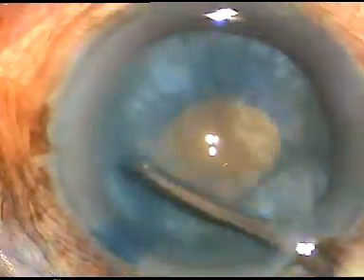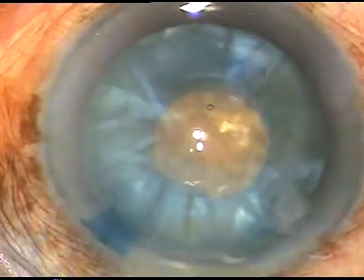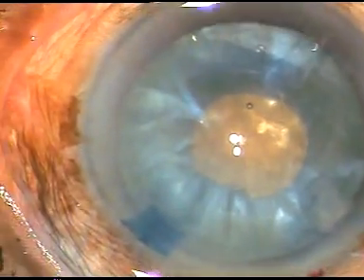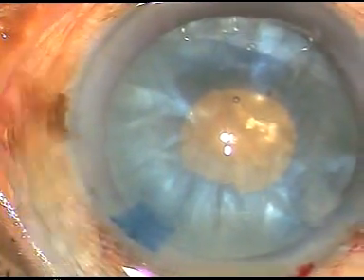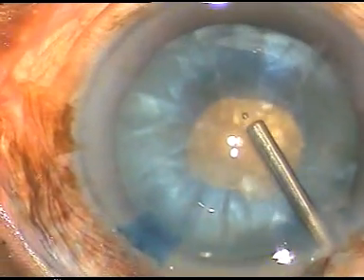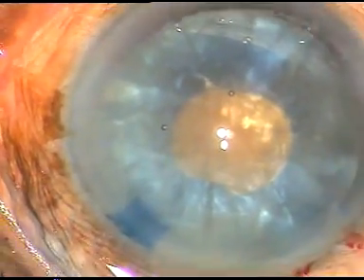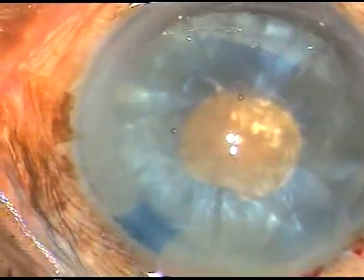Thus, when some substance of the lens matter comes out, the intralenticular pressure decreases and thus the intumescent cataract has been converted into a normal cataract.